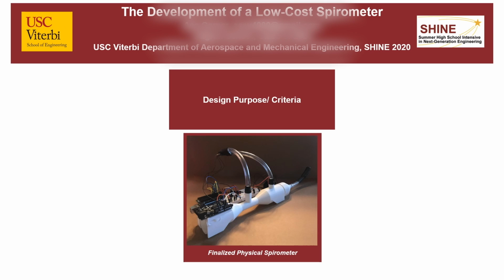I'm a rising senior, and during my time here at SHINE under Professor Luhar in the Fluid Interactions Lab, I have designed, developed, and tested a low-cost spirometer, a device which works to measure patient lung function through a variety of criteria. One of the main reasons I've been doing largely medically oriented work in the aerospace lab is due to the massive overlap they share in airflow physics.